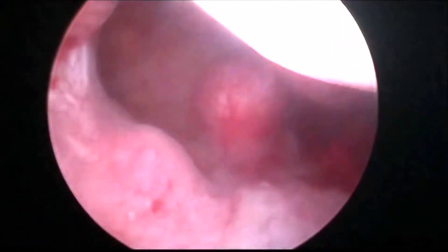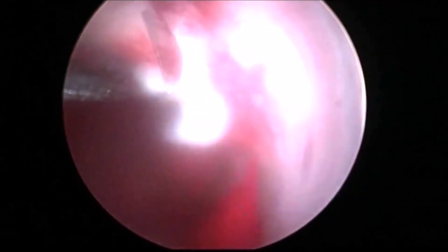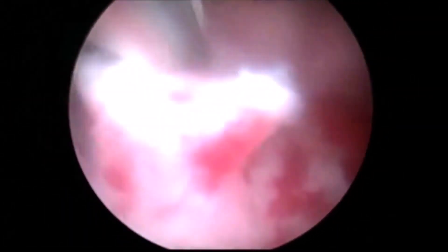It can be introduced through the hysteroscopic probe, and there is a foot switch through which you can operate it. It will grind and cut the myoma into small pieces while it is still attached to the uterine surface. It is not a very good procedure for grade 1 or grade 2 myoma, but for grade 0 submucous myoma, which is predominantly intracavitary, it is a good technique.